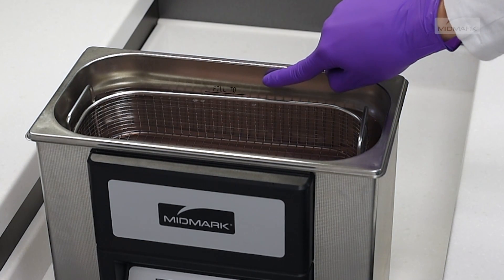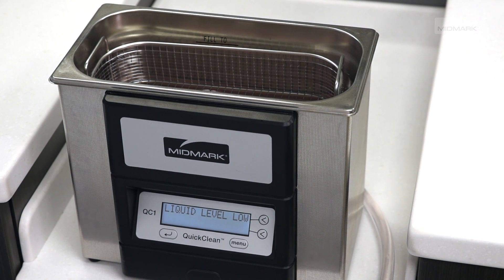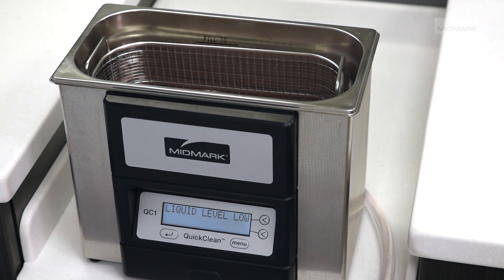If your liquid level is not to the fill line, you will receive the liquid level low message and your unit will not operate until it is filled to the appropriate level.